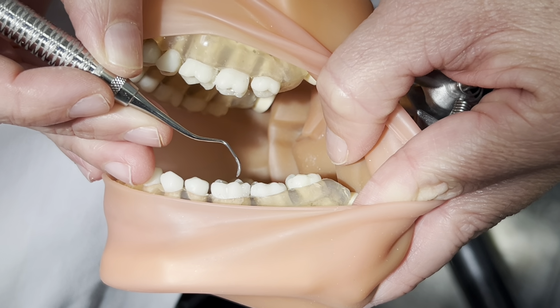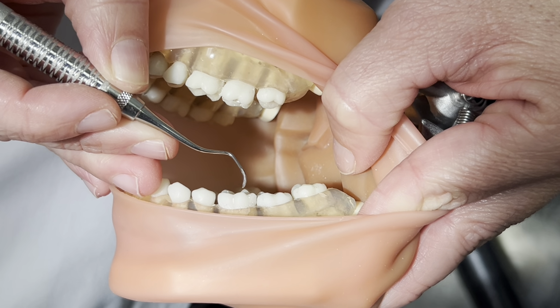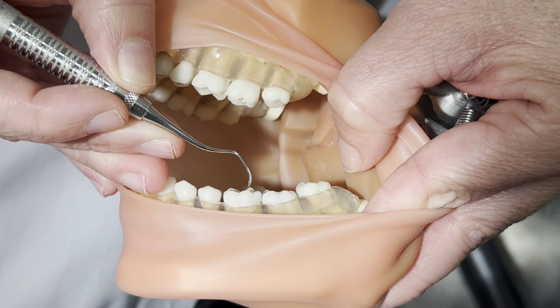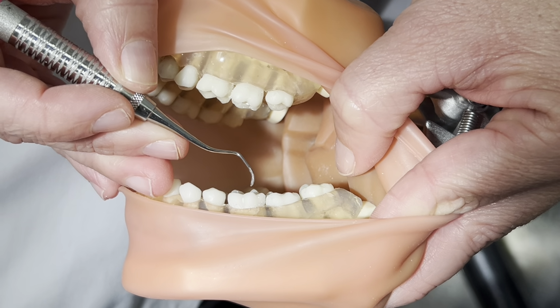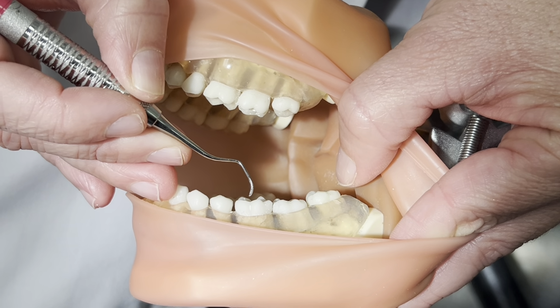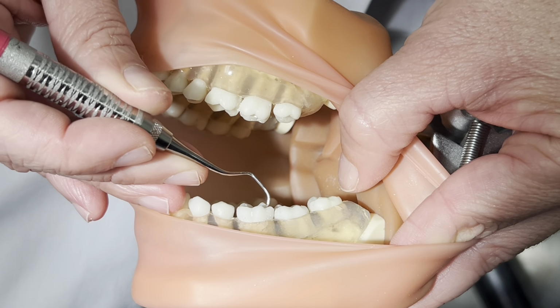Okay, this is lab activity number 12, instrumentation strokes, angulation, and calculus removal. The first part of this lab activity is to demonstrate a horizontal, oblique, and vertical stroke. We're going to apply those strokes on this first molar of quad 3, starting with a horizontal stroke.